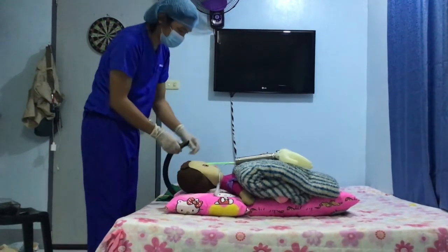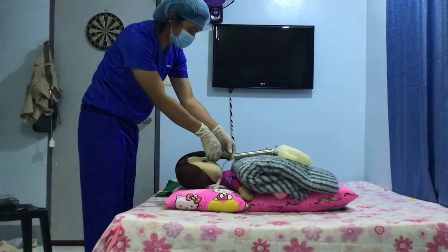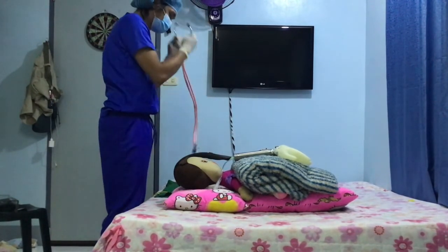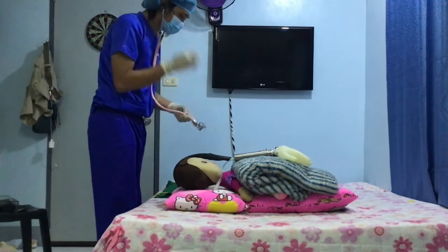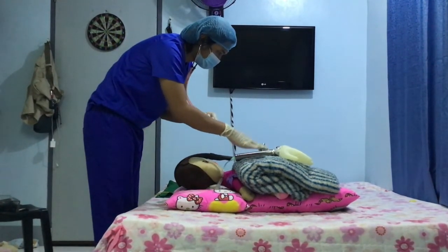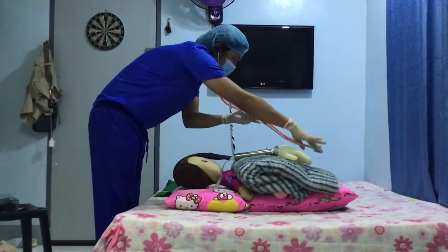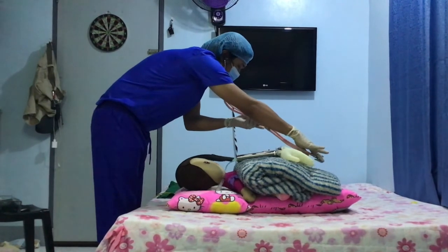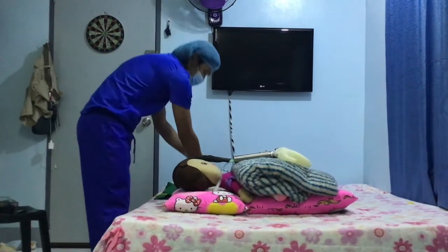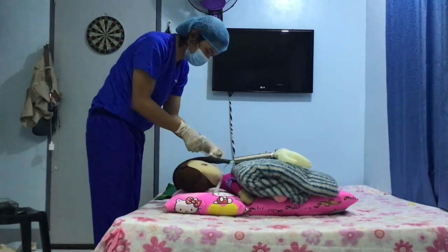Connect the patient to a breathing circuit, then check for chest rise and fall and chest expansion. With the use of the stethoscope, auscultate for equal breath sounds over the left and right infraclavicular, inframammary, and epigastrium. A capnograph measuring the end-tidal carbon dioxide can also be used. Lastly, secure the endotracheal tube with a plaster.